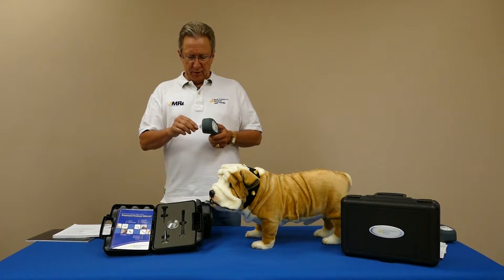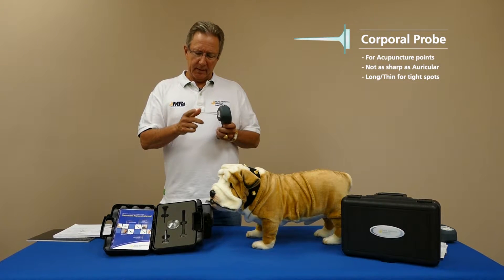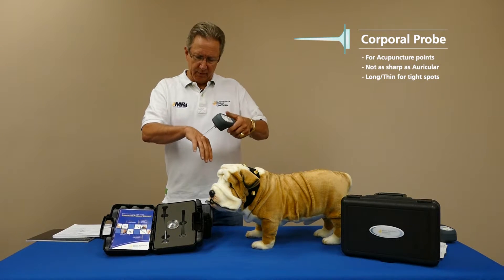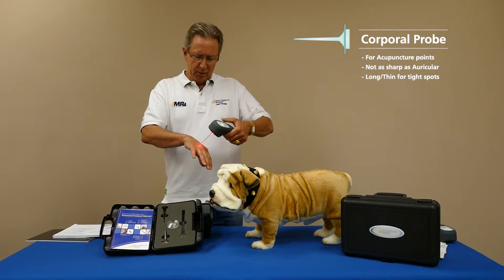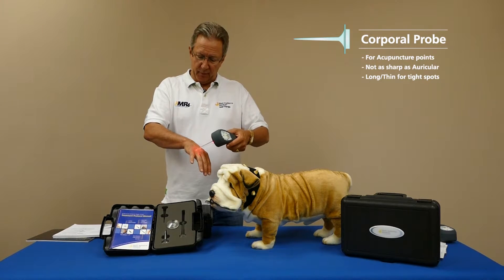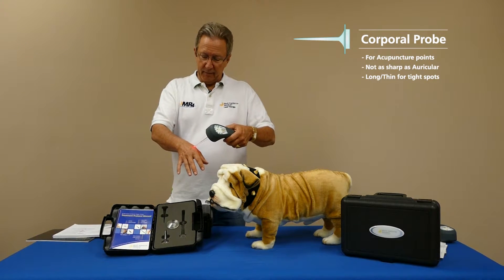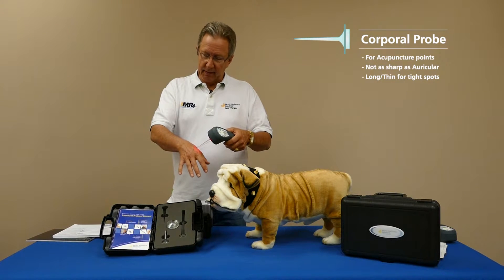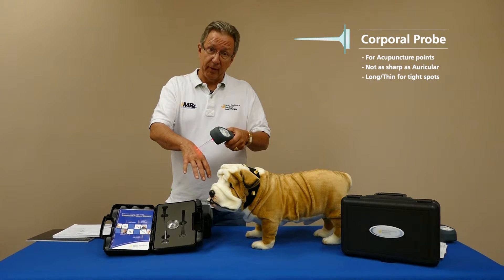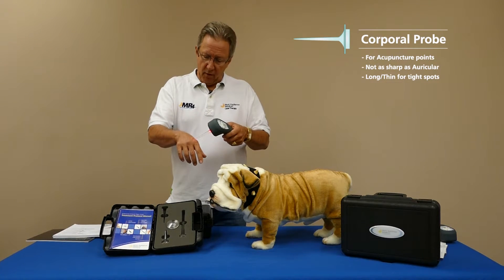Many practitioners prefer to use the corporal probe because it's not quite as sharp — it's longer but more blunt on the end, so it's easier to place against an animal without a reaction to the sharper tip. The same principle applies: turn it on, 15 seconds per point, and plenty of energy along that meridian or neural pathway — whichever your preference — to give you that profound response with laser instead of needles. Many vets have reported it can get tricky going down the leg of a cat, but with this there's no skin penetration and animals find it much more relaxing. It can also be much faster. That's the corporal probe — also very good for acupuncture.